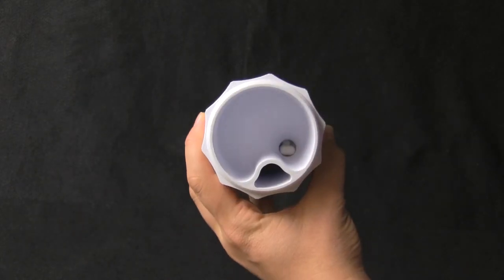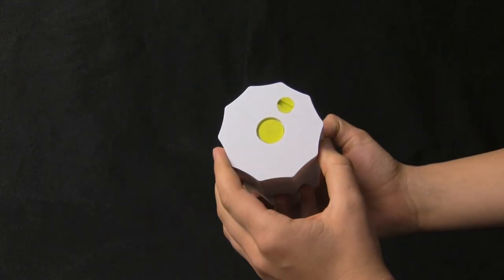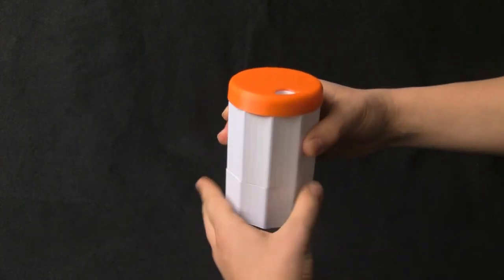Here is our final pill bottle. This meets every requirement set forth by our expert Steve. It is easy to fill and use, it dispenses pills one at a time, can be adjusted for different pill sizes, and it's ergonomic. And it's fully 3D printable. We used a spring that allows the bottom to snap back into position. Over to Steve to hear his final review.